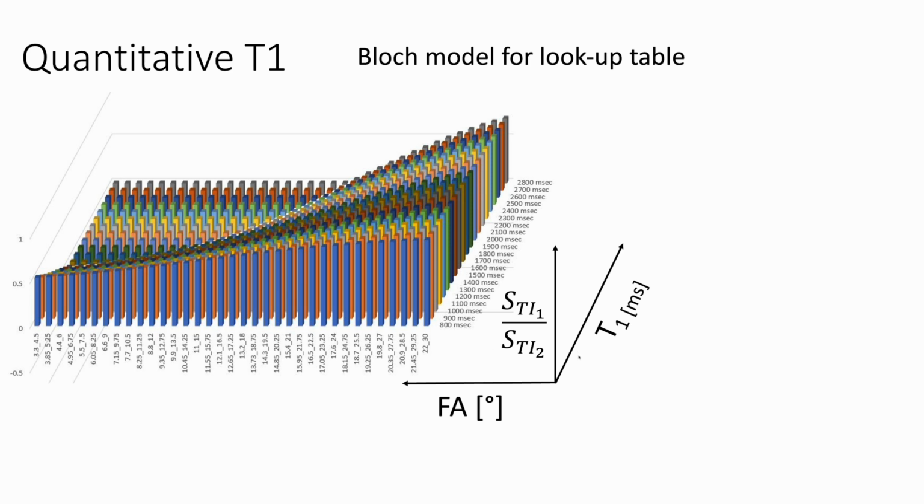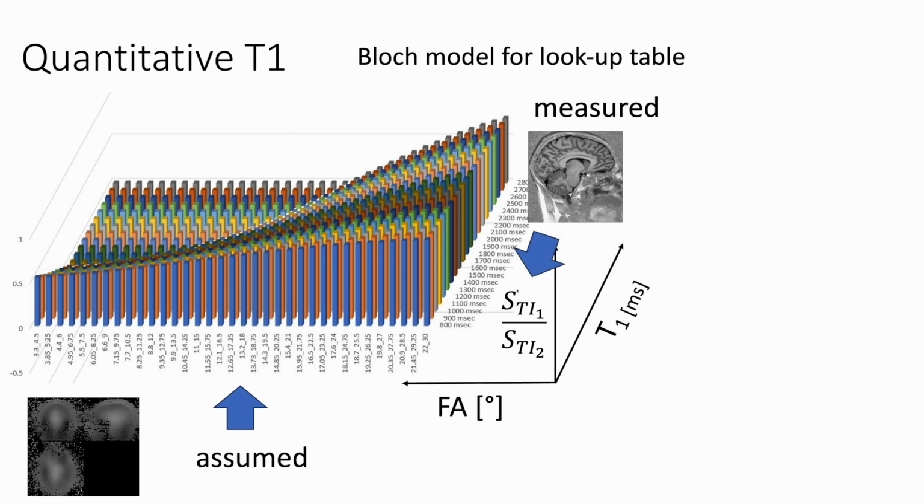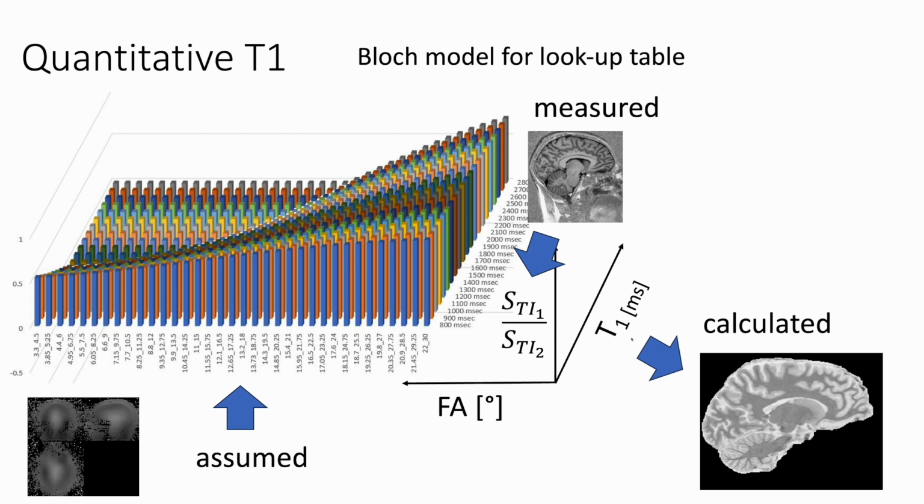And then as soon as we have this lookup table, we can actually invert it and see, okay, this is what we measured. The flip angle is something that we can assume based on our nominal flip angle, and the distribution is actually almost identical across people, the idea of the universal pulses. If you really, really care about it, you can also acquire a field map, which we didn't. The ratio is the thing that we measured, so then we can use the lookup table to calculate the T1s based on that, while optimizing contrast to noise ratio.